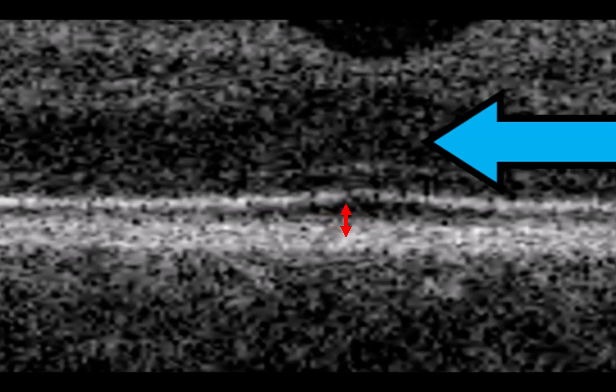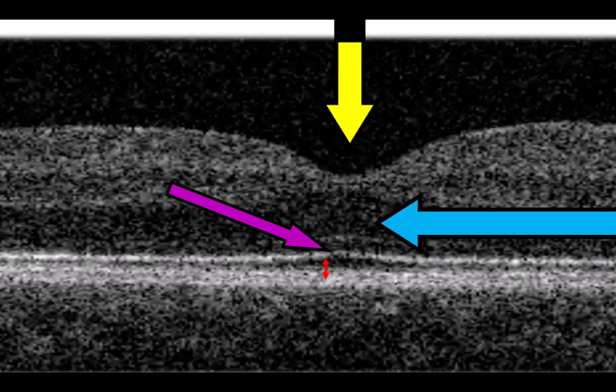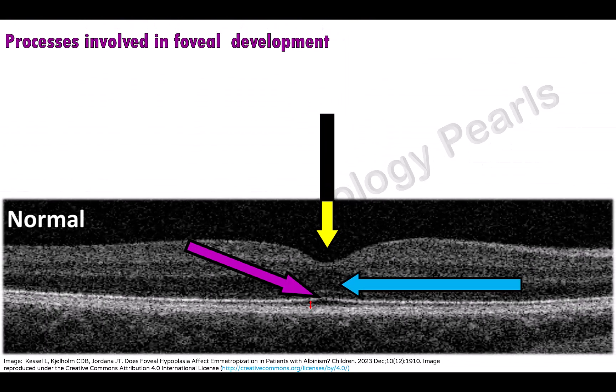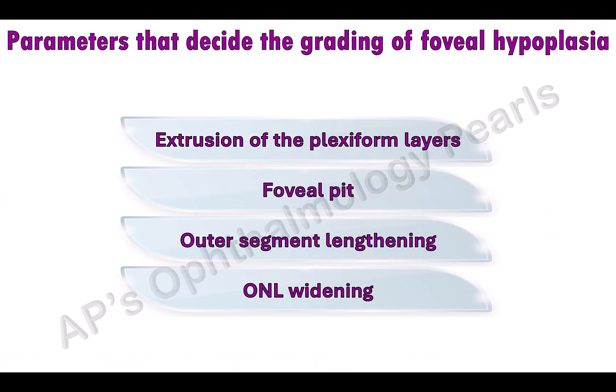This results in this little elevation here. When we have to decide the grade of foveal hypoplasia, these are the parameters that we have to look for in the OCT.